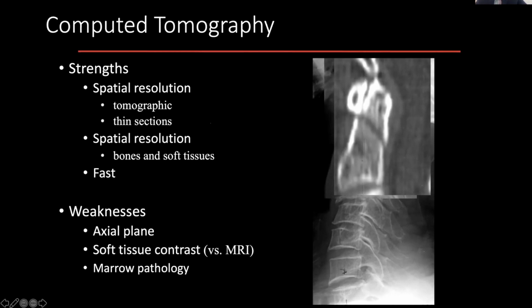And again, the good thing about CT is that it is widely available. Most of you will have a CT scanner available, if not in your emergency room, then immediately adjacent to the emergency room. Similarly, if not in the OR, then immediately adjacent to the OR, probably. And so this is very accessible, very quick, and has very few limitations as compared to, for example, MRI.